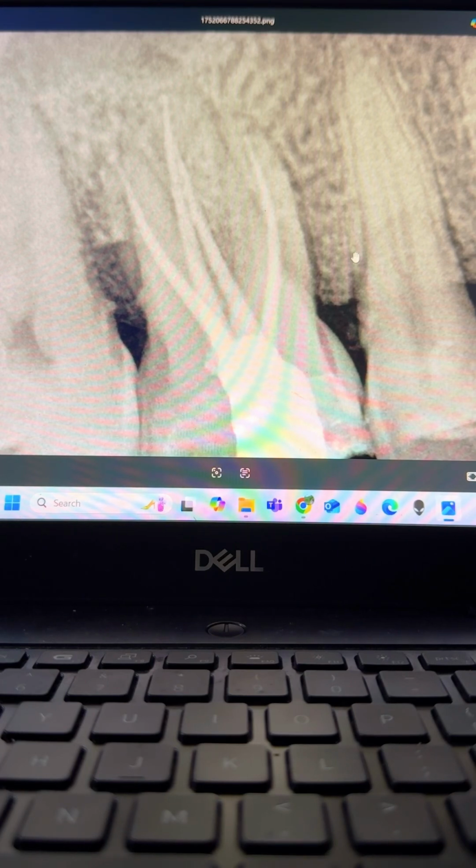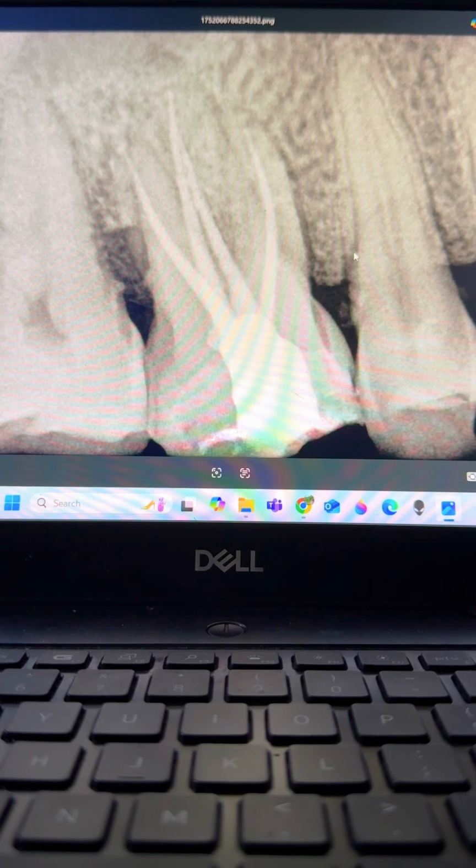And in this case, the patient had actually come for treatment of this tooth because there was an acute periapical abscess. So even if I went beyond the anatomical apex using tactile sensation, the patient would not have pain. That's why I still decided to go with the apex locator, although the tactile sensation method and the radiographic method were suggesting different working lengths. Please let me know what you would do in this situation. Thank you.